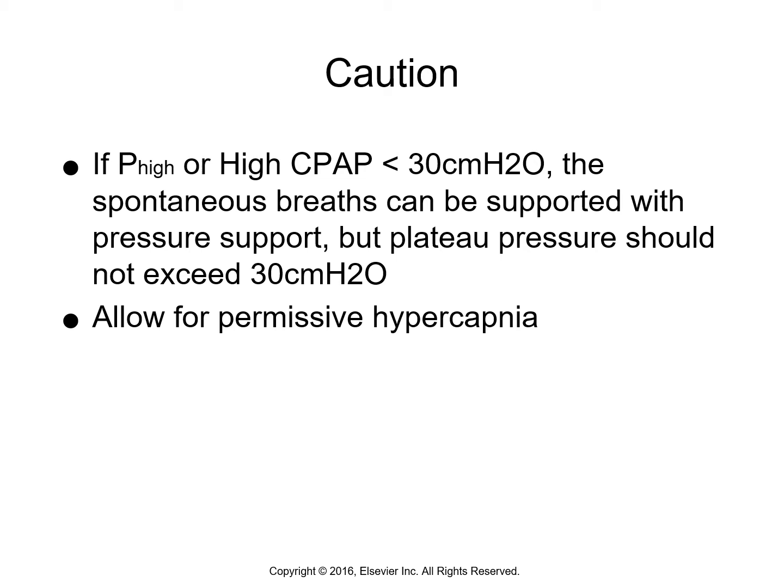Keeping in mind, if your P high or your high CPAP is less than 30, then the spontaneous breath can be supported with pressure support. But the plateau should still not exceed 30 centimeters of water. So you can also add pressure support. Gary from Puritan Bennett or Medtronic has actually come to our school before.